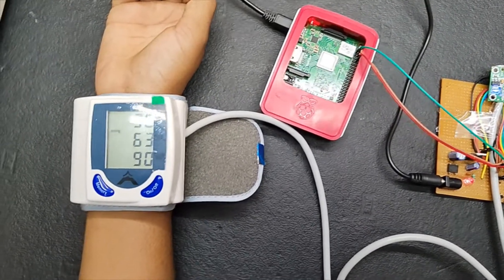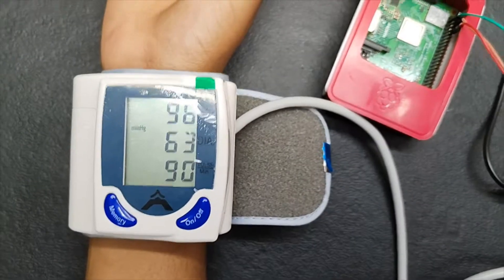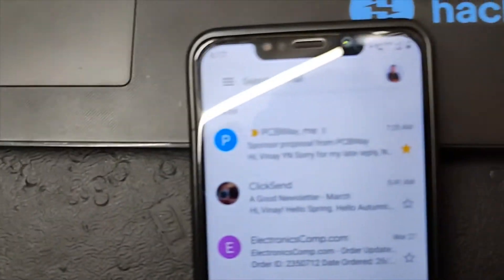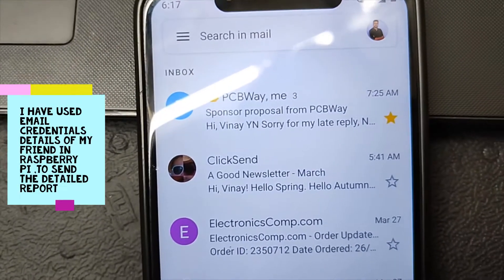Blood pressure data is being displayed on the sensor as well as on the console. So after a few minutes, the report will be sent to me.